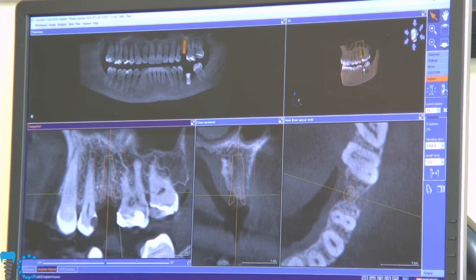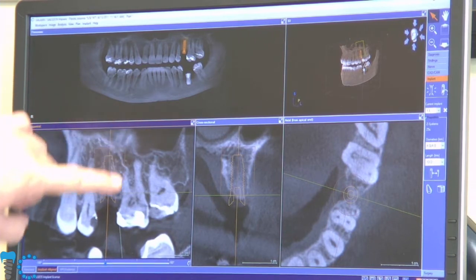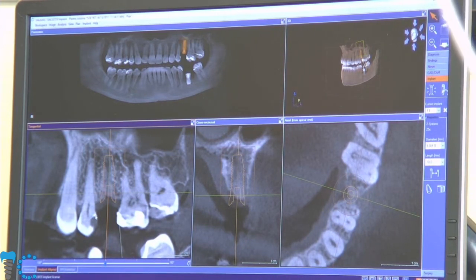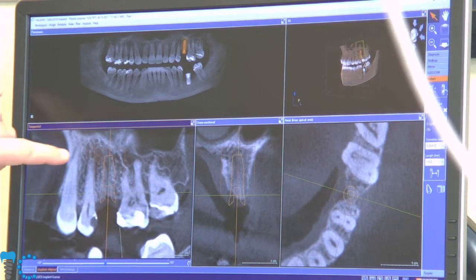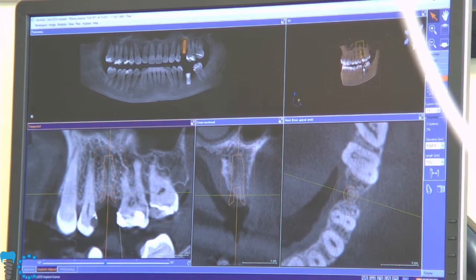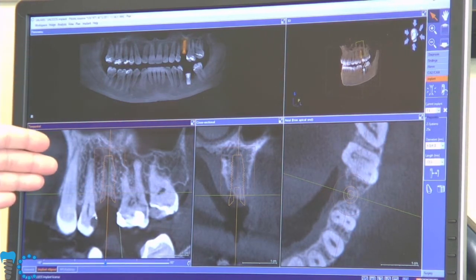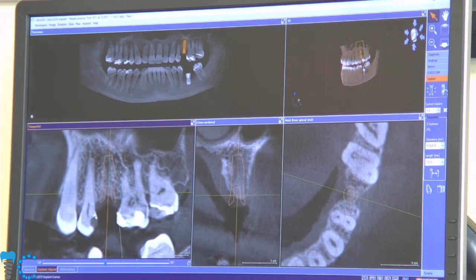And we look at this 4 millimeter implant. What we have drawn here, I don't know if you can see it on camera, but we have a 2 millimeter box drawn around the implant where all these lines are 2 millimeters away from the implant itself. And this, we can adjust the size of that box. For example, making it 1.5 millimeters away would be a good choice also, because that's the minimum distance that we want between our implant and adjacent tooth root. If we're placing consecutive implants, we want 2 millimeters of space between consecutive implants.